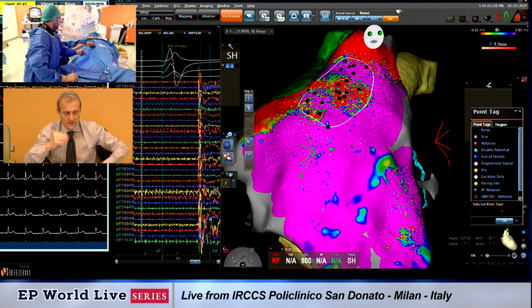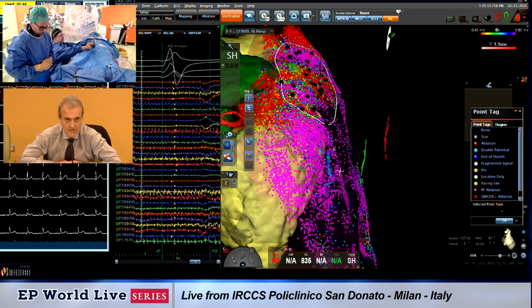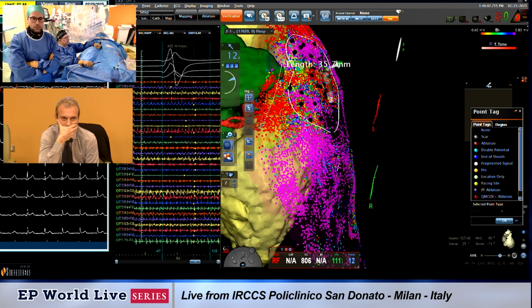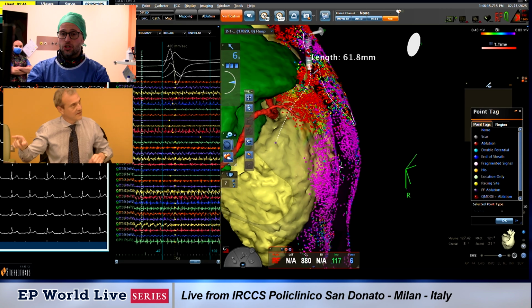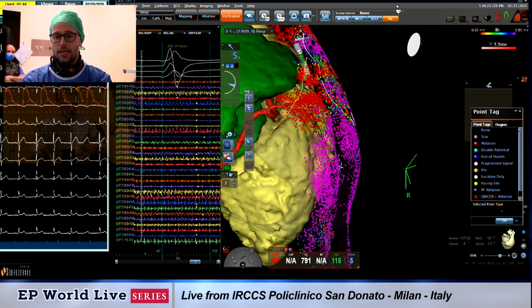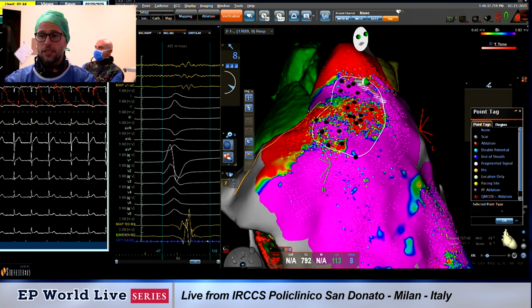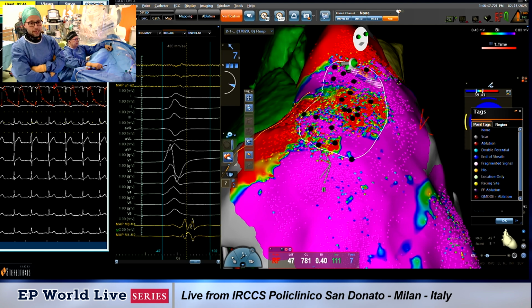Giuseppe, we have many questions from the audience, mainly focused on what are the criteria for catheter ablation in ER patients, and if there are other alternatives. So, of course, this is a severe patient with a severe history of cardiac arrest and frequent ICD shocks. So, considering the evidence of arrhythmogenic substrate and the localization of the arrhythmogenic substrate in this scenario, we expected to find abnormalities in this case, and this is our target for ablation. Of course, the indication is driven by the history of the patient, history of cardiac arrest, and frequent ICD shocks. Of course, in the future, we expect that the epicardial approach will be even broader.